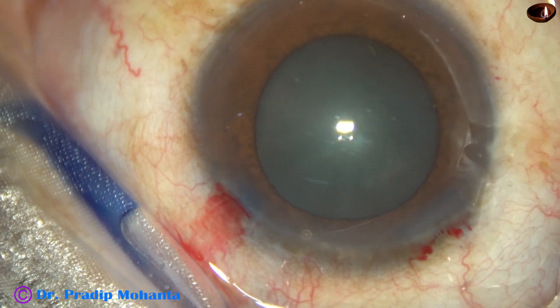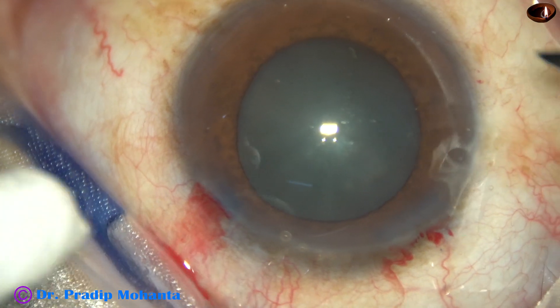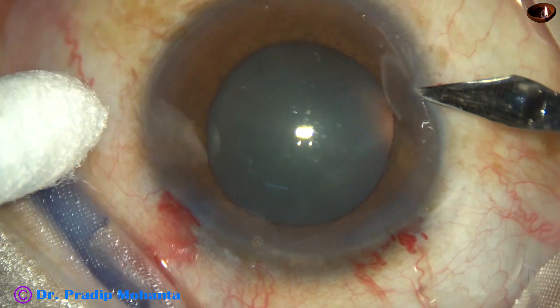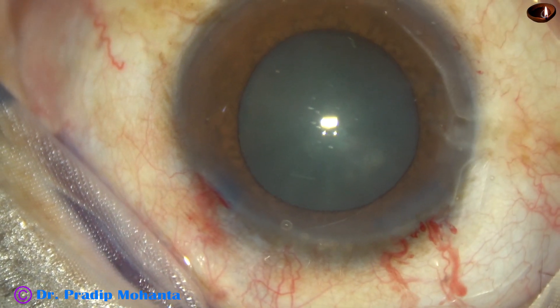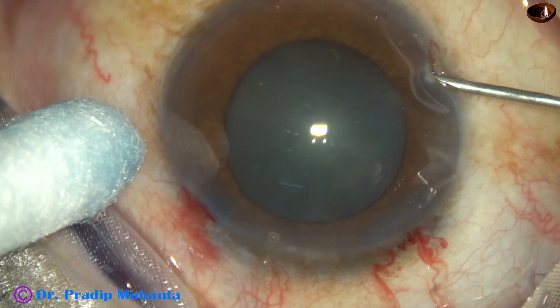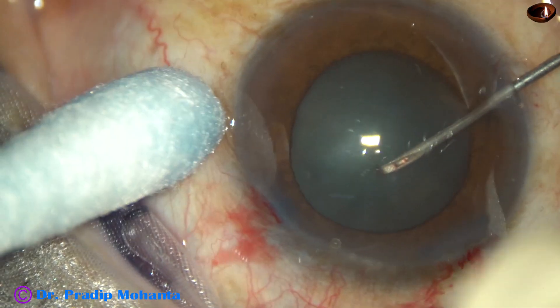Now one more side port is made on the right side of the main incision at around 8:30, that is 2.5 o'clock away from the main incision on the right side. And here is the rhexis.